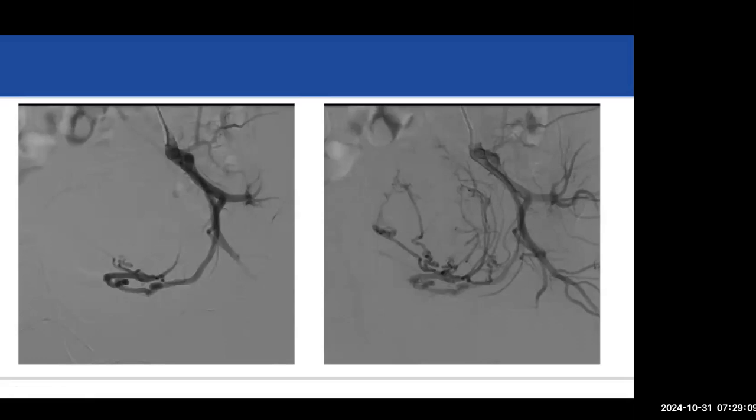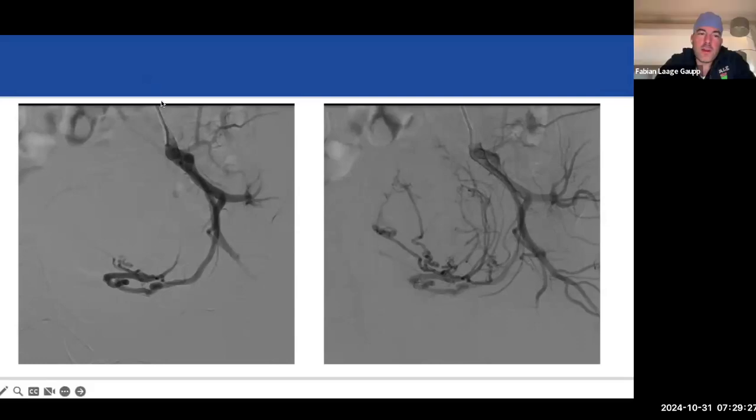From these DSA images, with the catheter coming from the contralateral side, that means we've accessed on the right side. So first of all, no, this is radial. The catheter here is just coming from above. But what I'm asking is, what's the easiest way to get into the internal iliac artery? Do you just look AP, or is it helpful to angle the tube ipsilateral or contralateral?